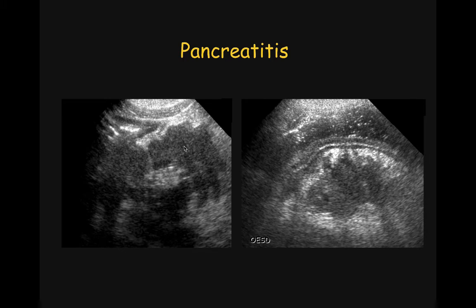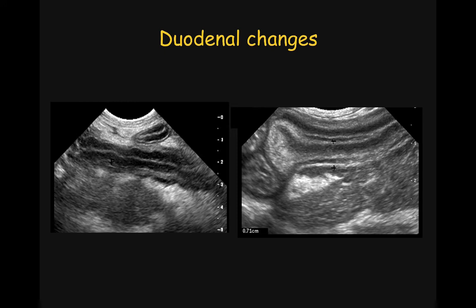The inflamed pancreas is enlarged and poorly echogenic, also surrounded by hyperechoic fat. Adjacent visceral organs such as the descending duodenum in these two dogs can also appear thickened. We see the thickening of this longitudinal segment of the descending duodenum highlighted by hyperechoic fat near the inflamed pancreas. In this other dog, the descending duodenum showed marked thickening reaching up to 7 mm. The wall is measured between the calipers and we see that the layering is somewhat affected. The thickened inflamed pancreas is well seen and also surrounded by hyperechoic fat.